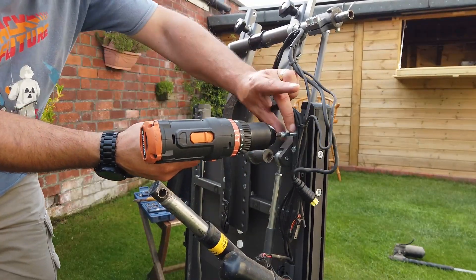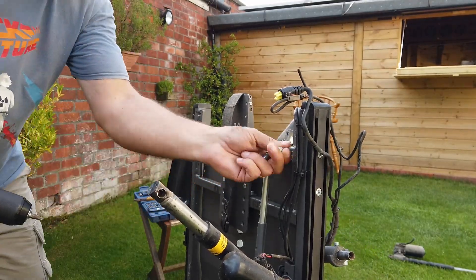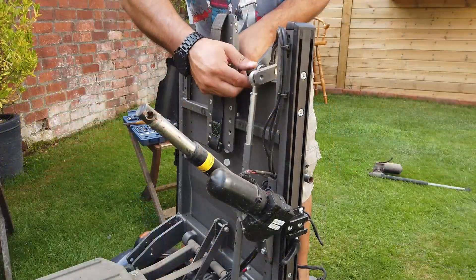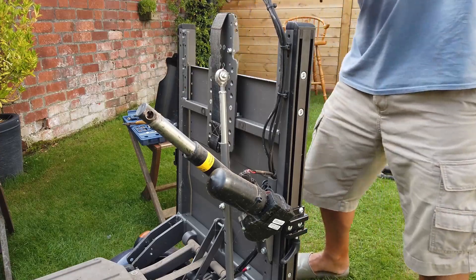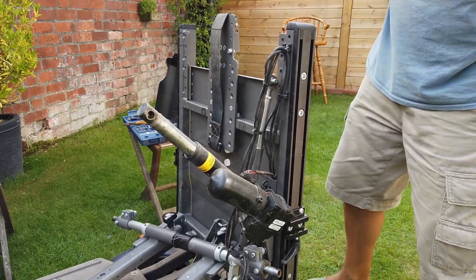At this point I threw caution to the wind and decided to start undoing as many bolts as I possibly could, sort of focusing in the areas I wanted to disassemble but just cracking on with things. It was taking me a little bit longer than I'd expected — this thing was so well built, and there were too many goodies in here that I really wanted to get my hands on.